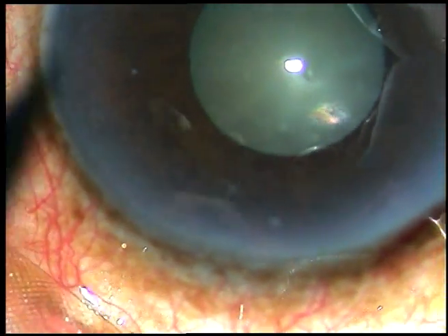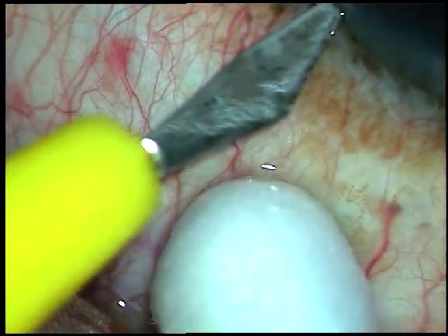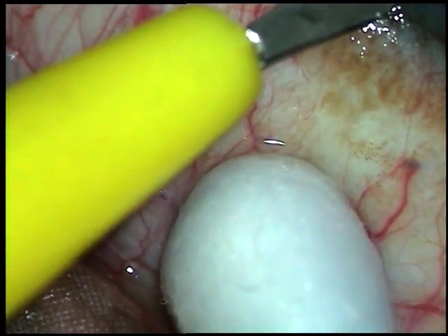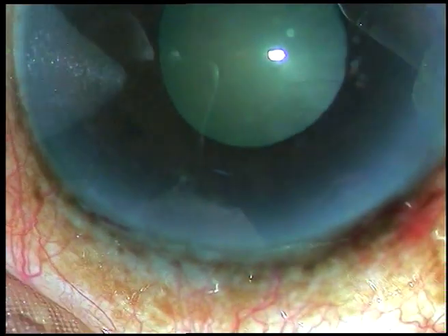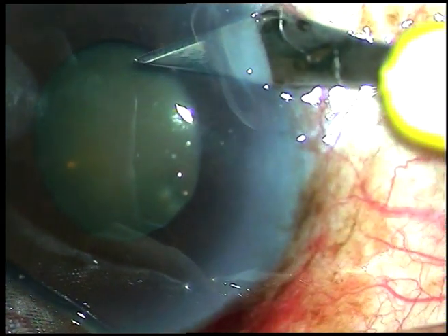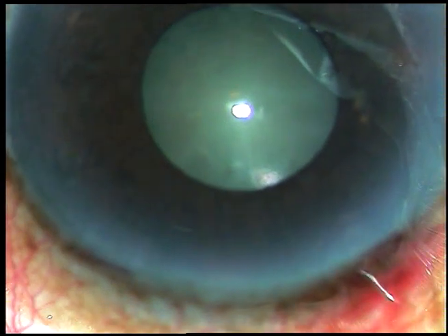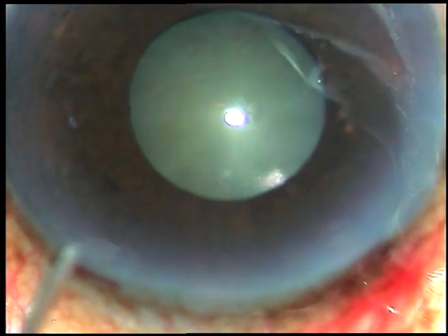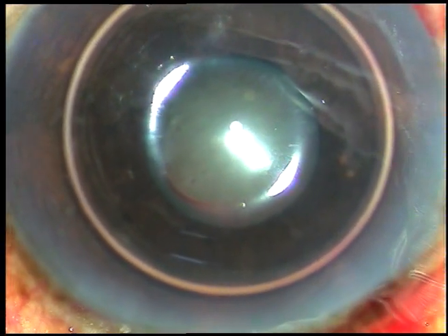I want to use a pupil expansion device. The pupil expansion device I like very much is B-hex. B-hex is Vortex hexagonal — it's a versatile pupil expansion device and the pupil takes a hexagonal shape after its application.